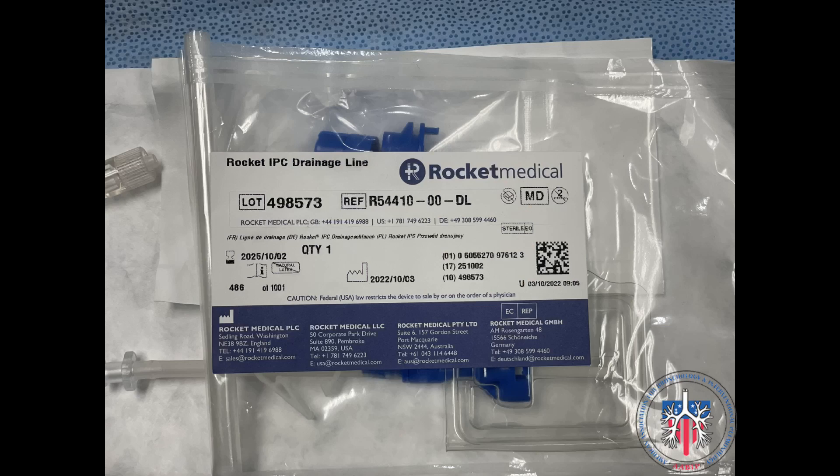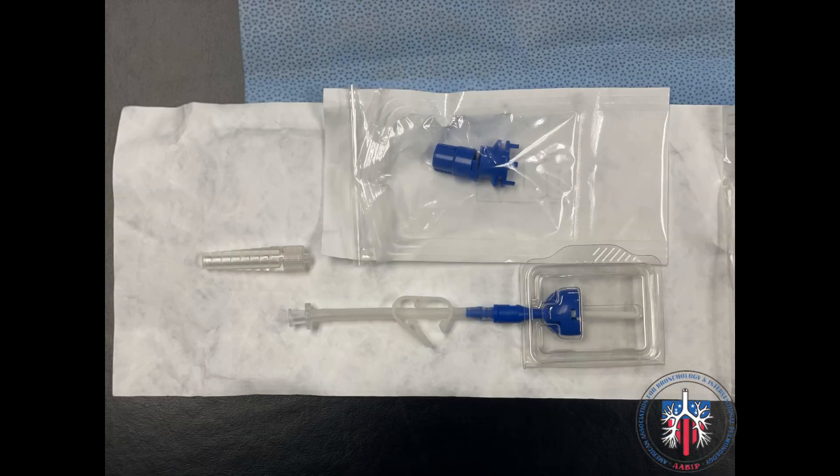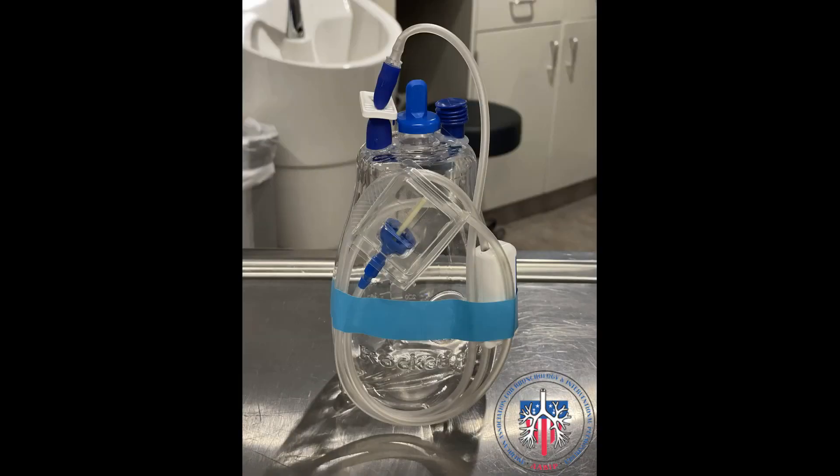We have an image of the Rocket Drainage Line. The drainage line allows us to connect the Plurorex Catheter to a chest drainage system. Lastly, we have the Rocket Drainage Bottle, which has been taken out of its packaging.